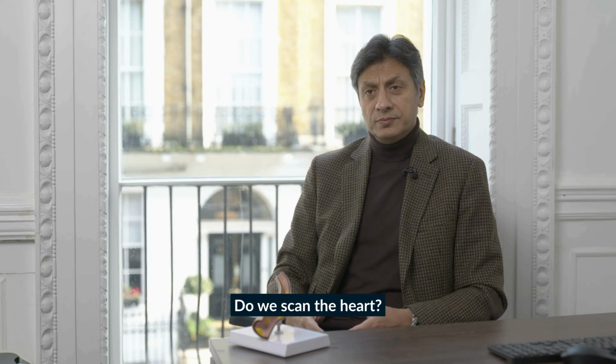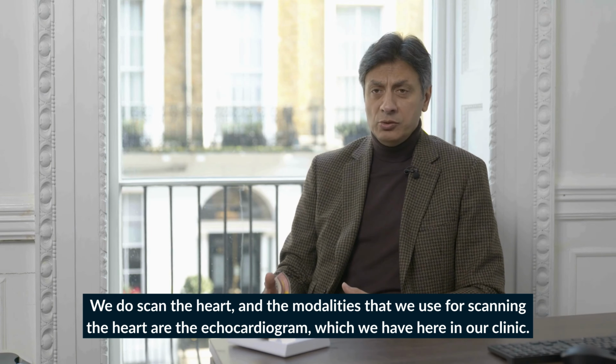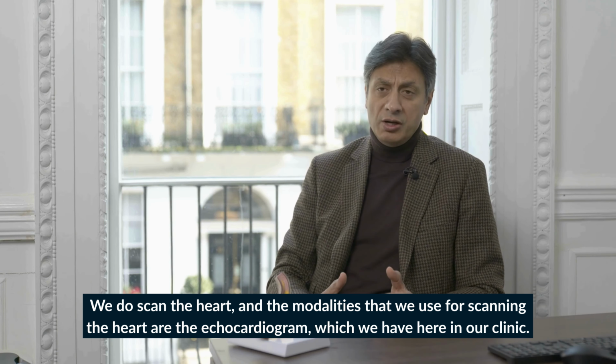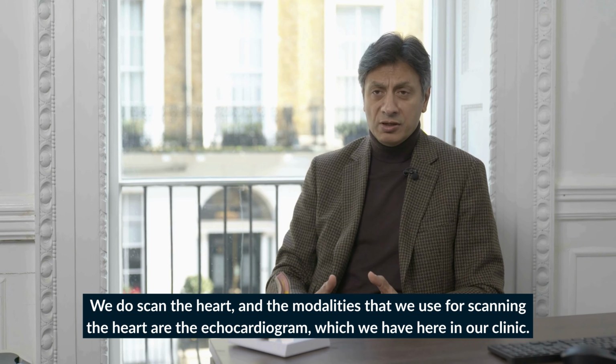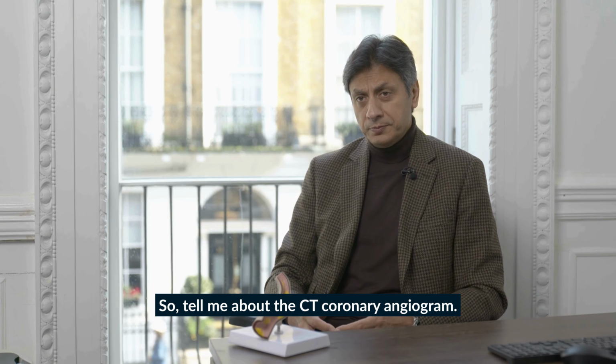Do we scan the heart? We do scan the heart, and the modalities that we use for scanning the heart are echocardiogram that we have here in our clinic. And in addition, we use a non-invasive CT coronary angiogram to look at the coronary arteries supplying blood to the heart muscle. So tell me about CT coronary angiogram.